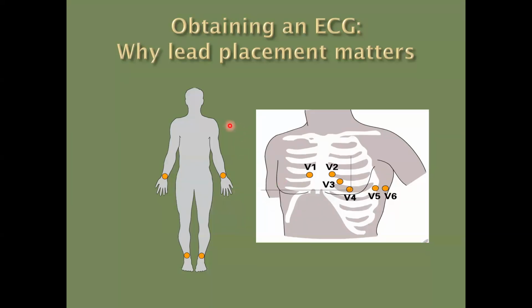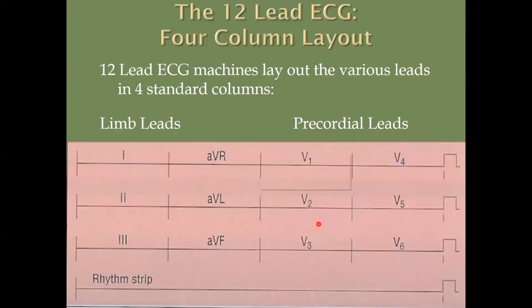That's part of the reason why they've gone to putting them more proximal on the extremity versus distal. And again, here's the picture that shows the precordial leads, the ones that are in the front of the heart. So don't put them down on the lower extremities distal anymore, just because of the artifact that it was causing.